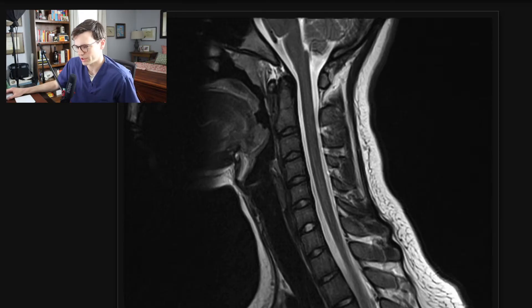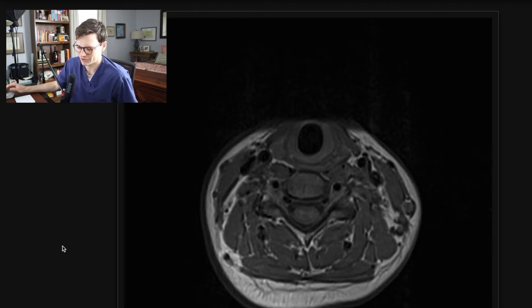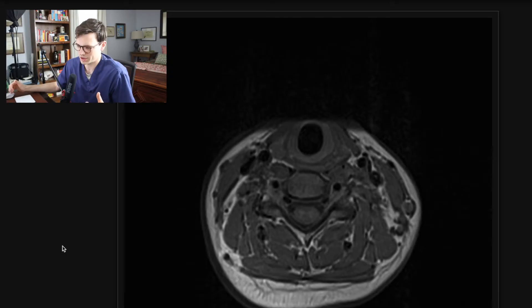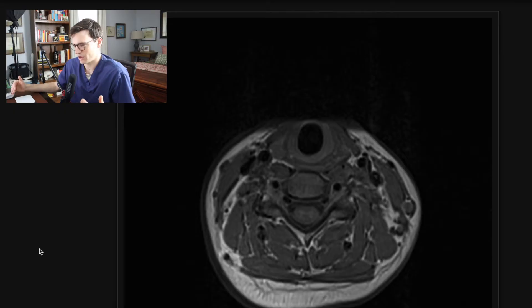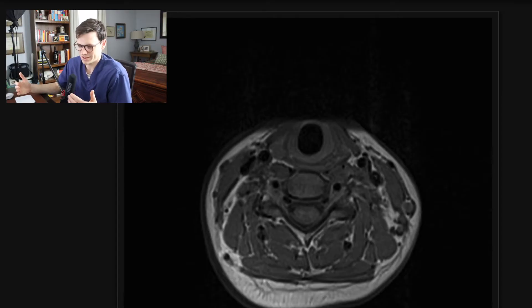A lot of cervical spine MRIs are ordered in the outpatient setting to evaluate for degenerative disease. A really important job of the radiologist is to go level by level and grade the stenosis — looking at the canal and the neural foramen. Grading how narrow those are helps surgeons potentially identify an operative level where they can alleviate the patient's symptoms. So it's important to go through and do that on every MRI cervical spine.